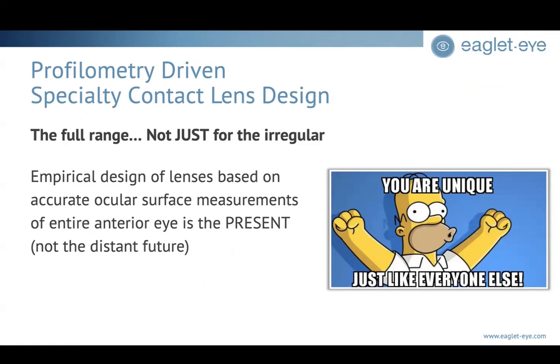Now, profilometry-driven specialty lens fitting is not just for the irregular eye anymore. In fact, it's one of the tools that we use as a mainstay. I love this slide because every eye has its own unique fingerprint, and you don't need an eye that is a very difficult shape to find profilometry useful.